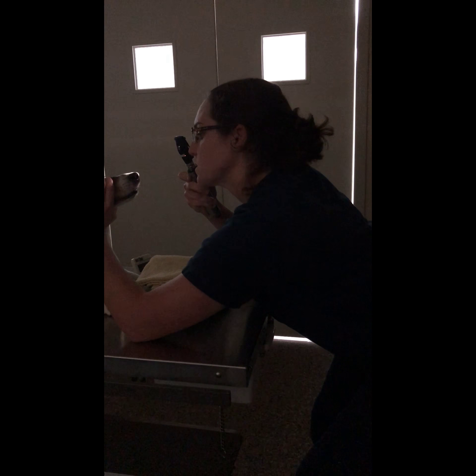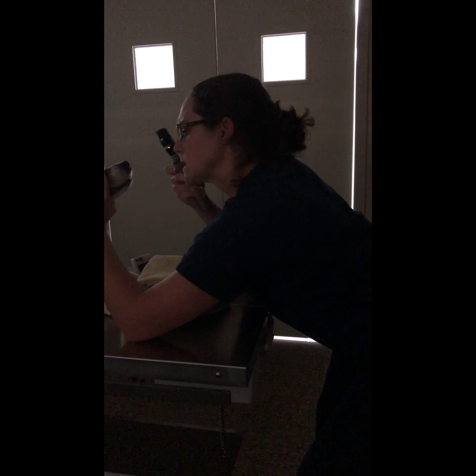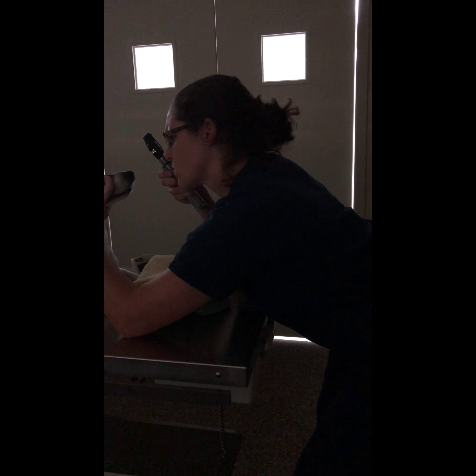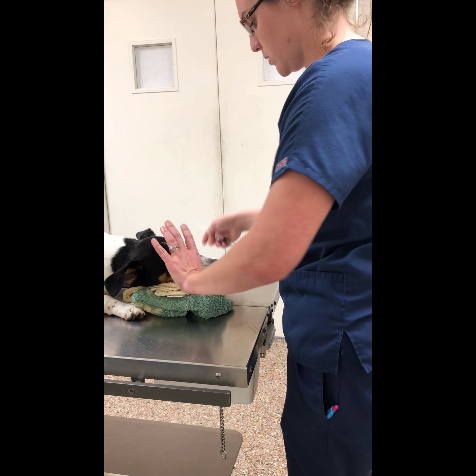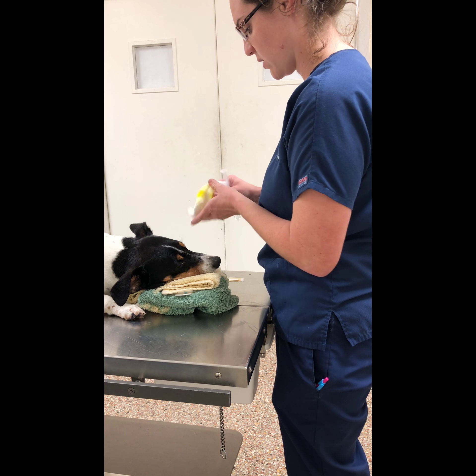I'm also going to check real quick just to see if he has any of the dye coming out of his nose, which he does not — which is not normal. Then we normally wet it one more time just to be sure that we get all that stain out.